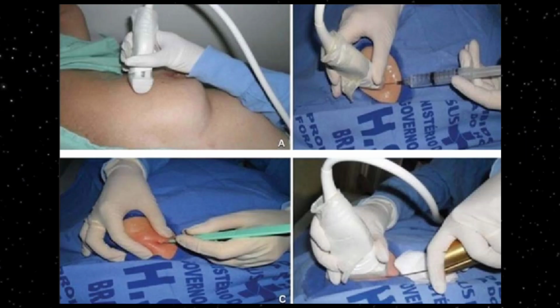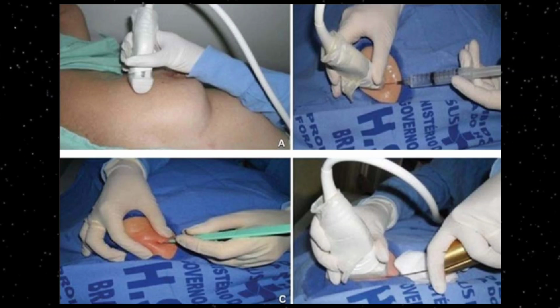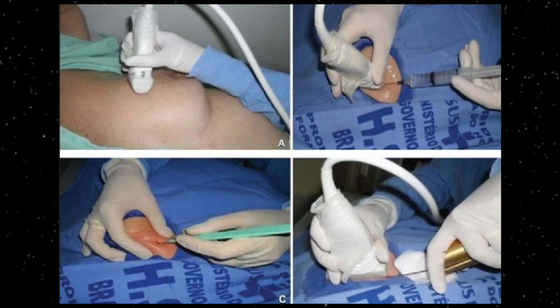Image guided biopsy is a very useful technique for histopathology purposes. The best technique is performed under ultrasound imaging. First you have to localize the area within the breast.